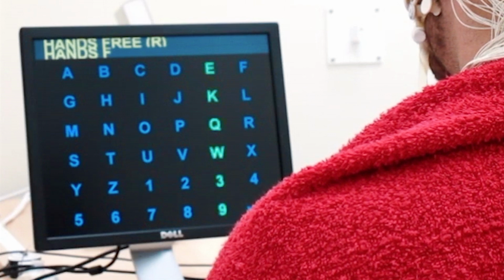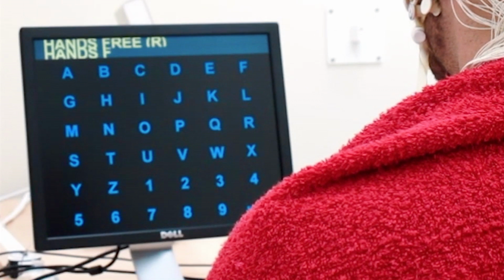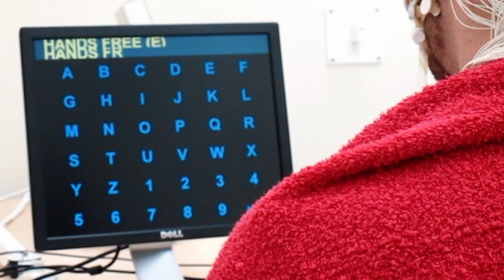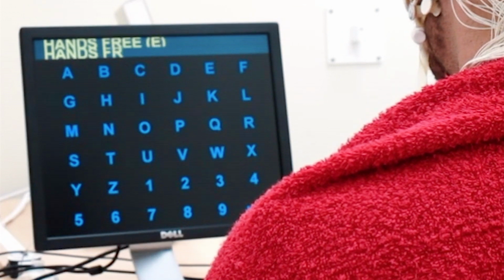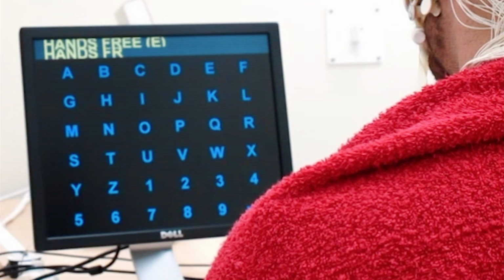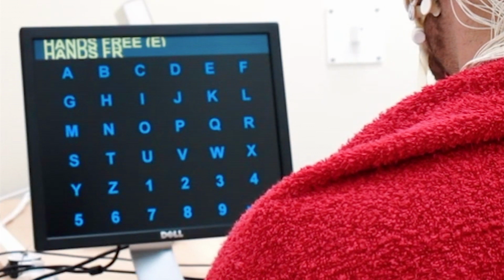In the case of a typing device, the patient is presented with a screen displaying a matrix of letters and symbols. The patient selects a letter he wants to type and waits for the letters to light up. Rows and columns are highlighted one by one. The patient notices the sign every time it's highlighted. For instance, he counts each highlight to himself.